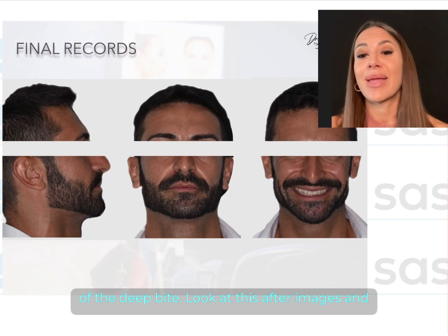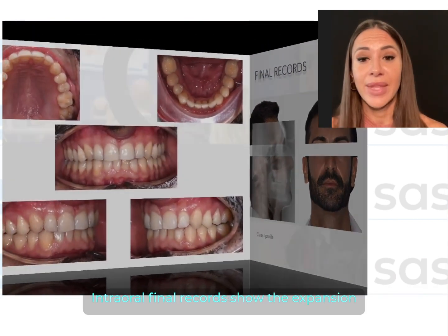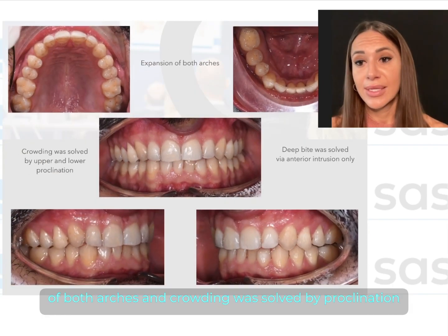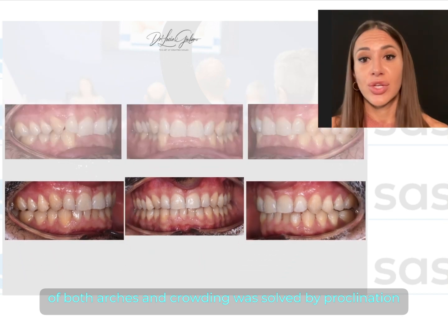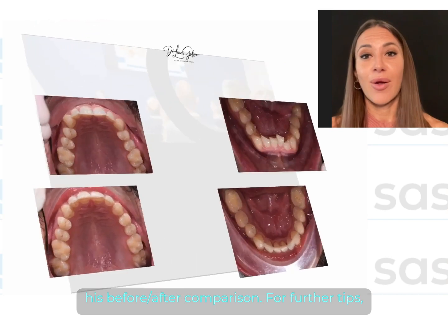Look at these after images, and we've achieved the deep bite resolution via anterior intrusion only. Intraoral final records show the expansion of both arches, and crowding was solved by proclination of upper and lower incisors. Finally, this is the before-after comparison.